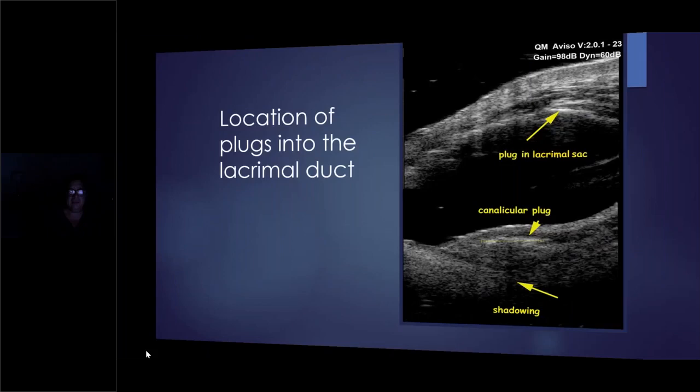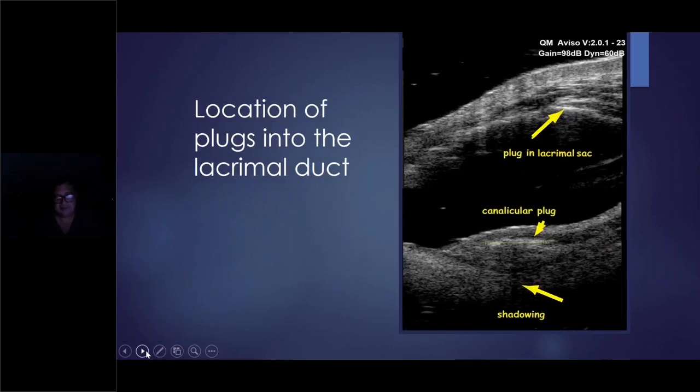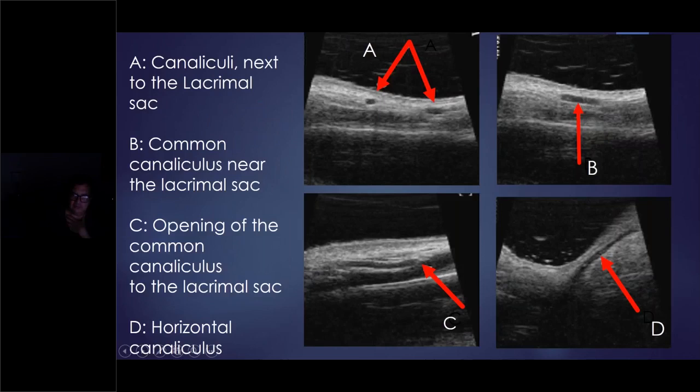And at the very end of my presentation, if in your practice you put plugs in the lacrimal duct and you suspect they are lost or they are inside the canaliculi, you can see it very well with the UBM. Not only that, but also with the 50, in these cases, next to the canaliculi, next to the lacrimal sac, the common canaliculus, the opening of the canaliculus and the lacrimal sac, and the horizontal canaliculus. Very nice to demonstrate the lacrimal system and also whether the plugs are there or not.